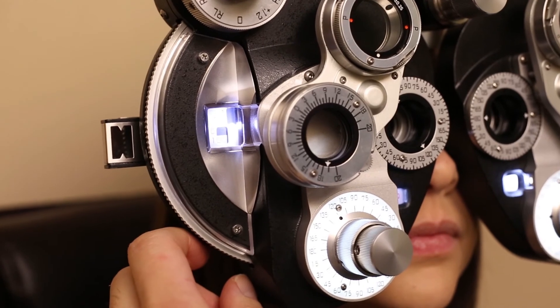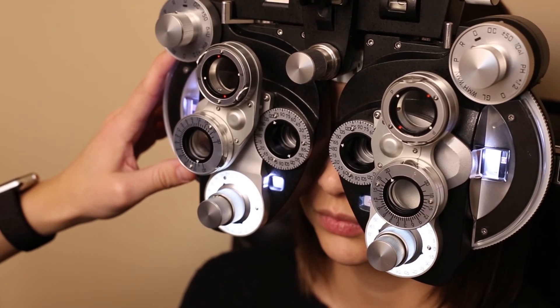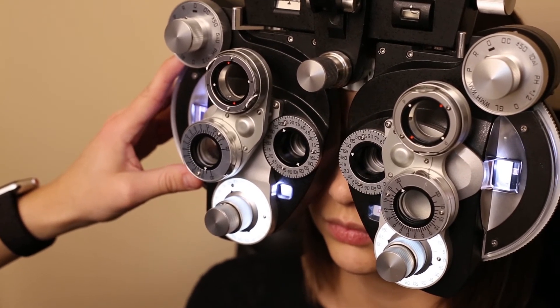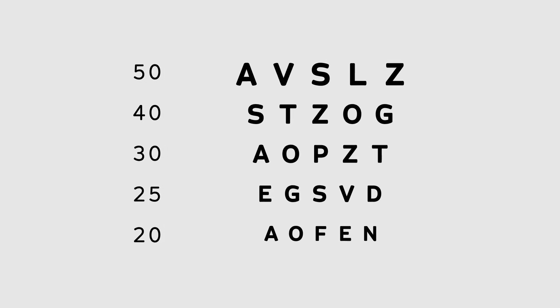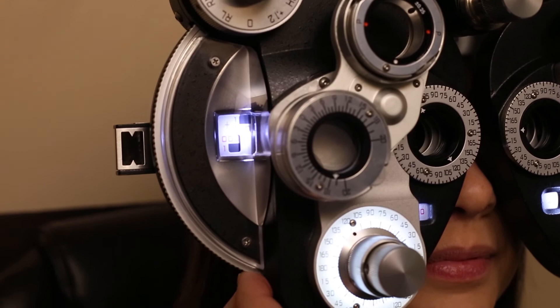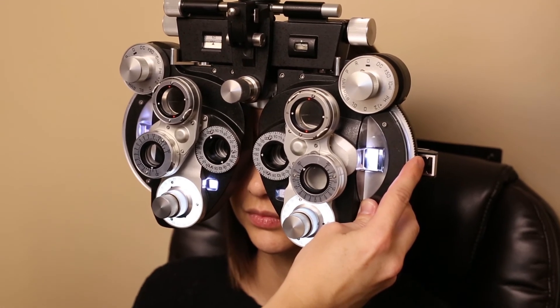You're almost done — let's finalize it. It helps to go back and do one last thing with spherical power to make sure the lenses you've added haven't changed anything. This test is called clicks to blur. We're looking for the specific number of clicks it takes to make the 20/20 line absolutely impossible to read — not when it's blurry, not when they can barely do it, but when it's absolutely impossible. Add power to the sphere one click — one quarter diopter — at a time. The correct number of clicks that should blur a 20/20 line to absolutely impossible is three clicks. If there are more, you've accidentally over-minused the patient — increase the minus by three clicks from wherever it becomes impossible and see if they can read the 20/20 line perfectly. They almost always will.